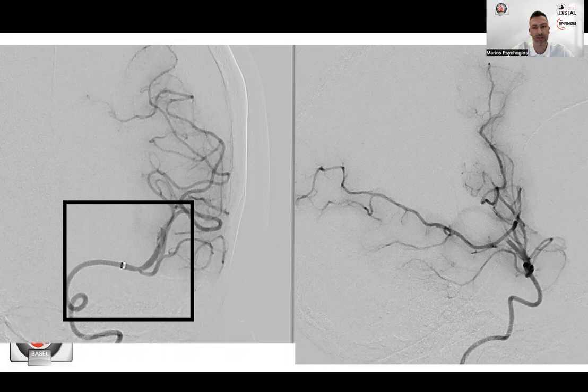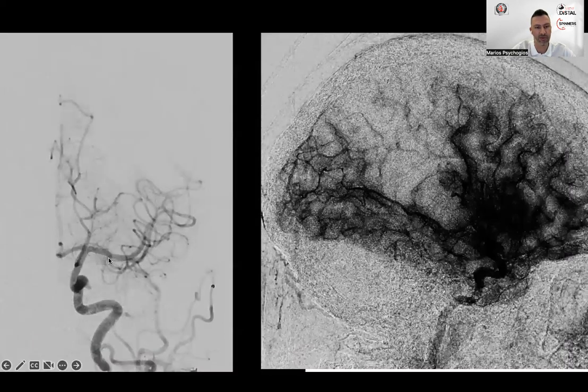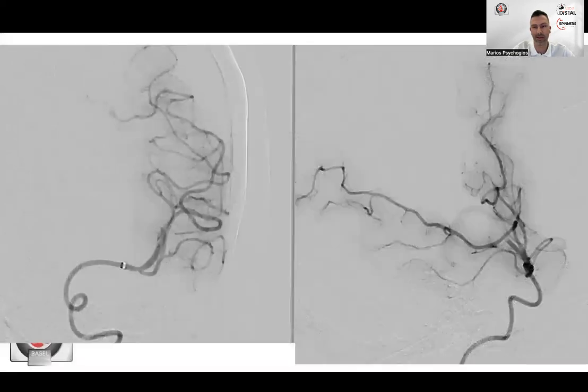And I also find it nice to see here that this ventral part of the MCA territory is not being shown because it's provided by the anterior temporal artery, obviously, that on the last slide you can see is coming out from the mid M1 segment, right? So this is a small variation of the segments, but again, nicely seen here, the occlusion in the M2 branch.